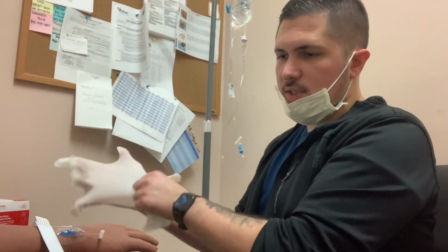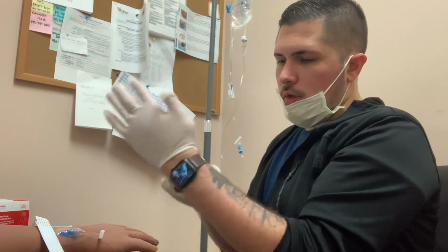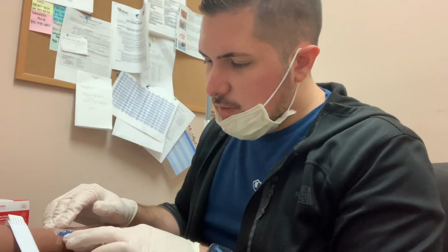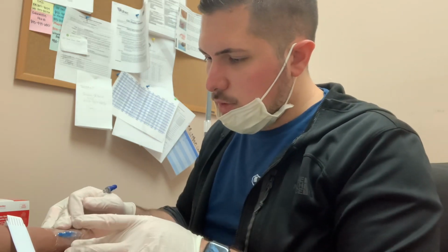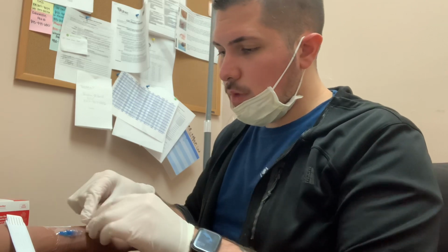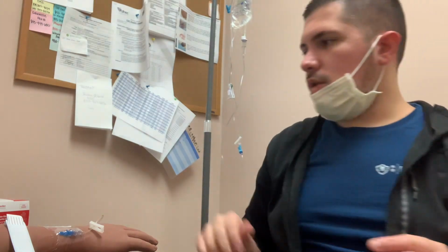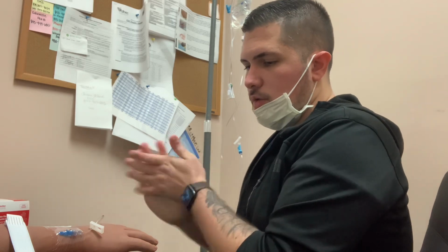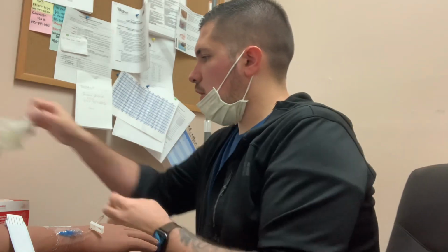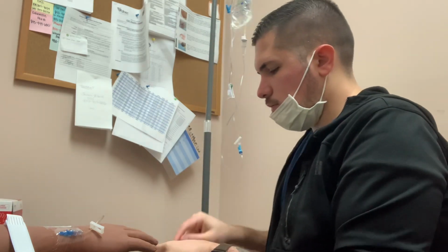Gloves, and we're going to assess our IV site. There's no signs of infiltration, redness, phlebitis. The IV is patent. No pain or tenderness. Alright. Take those gloves off. And now we are going to connect our normal saline for infusion.